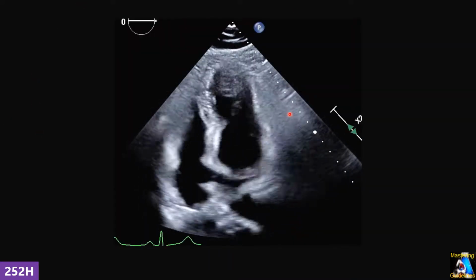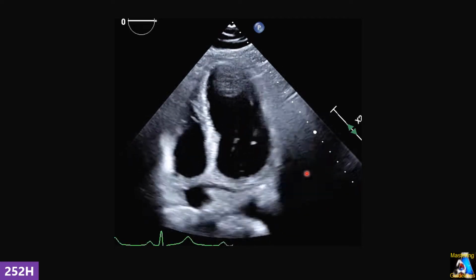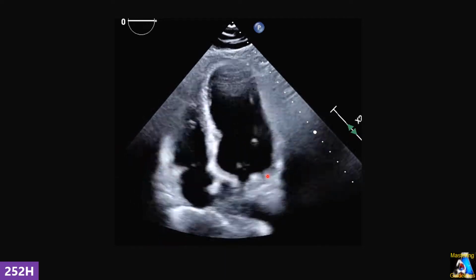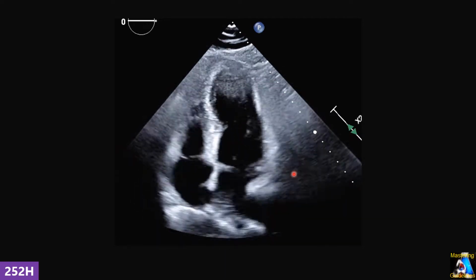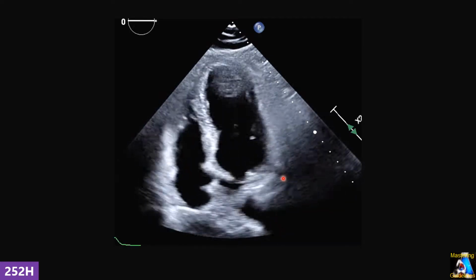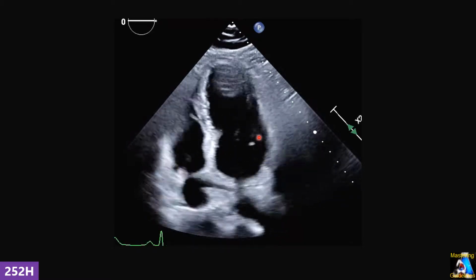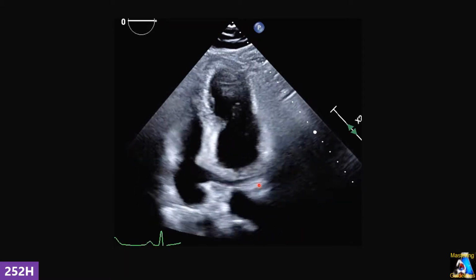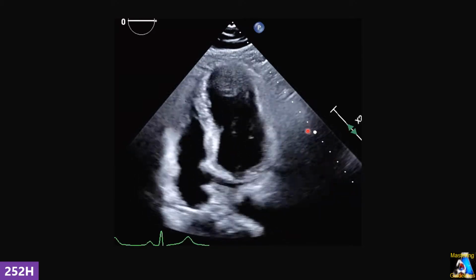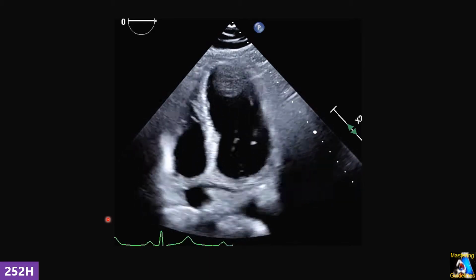Here you fixed it from the previous one, and now you get this view. Is that a correct apical 4 or not? If not, what maneuver should you do? Only one maneuver, without anything else, can fix this apical 4. What is it, and what view is this one? What do you call it? And another thing, do you see any significant artifact? What is its name?